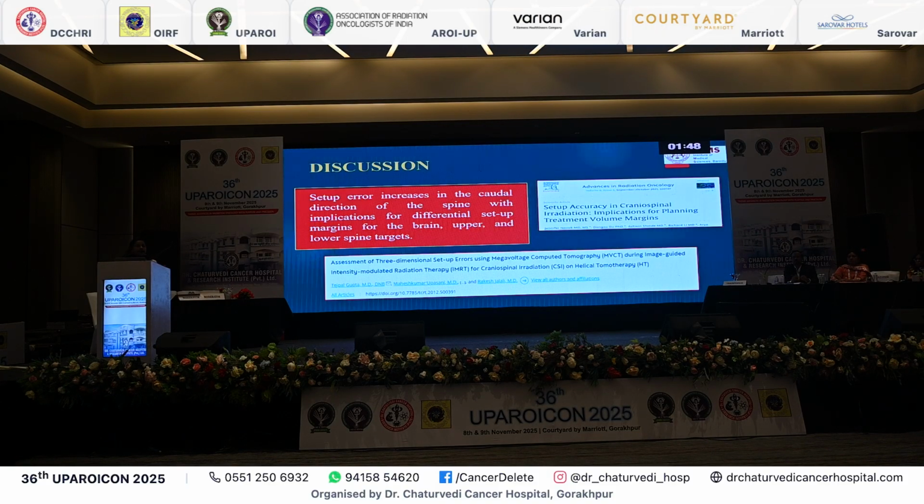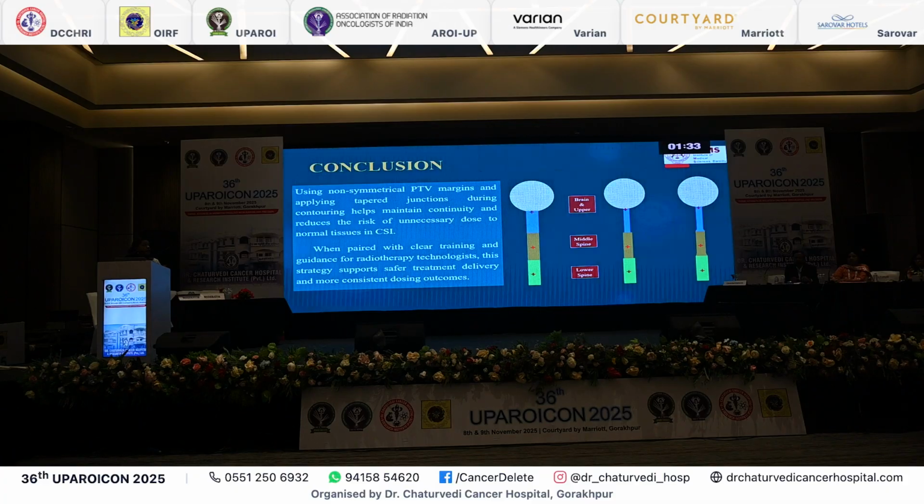These are the studies which show results similar to my study, that margins increase in the caudal direction of the spine, with implications for a differential set of margins for the brain, upper and lower spine targets. So, to conclude from my study, using a non-symmetrical PTV.